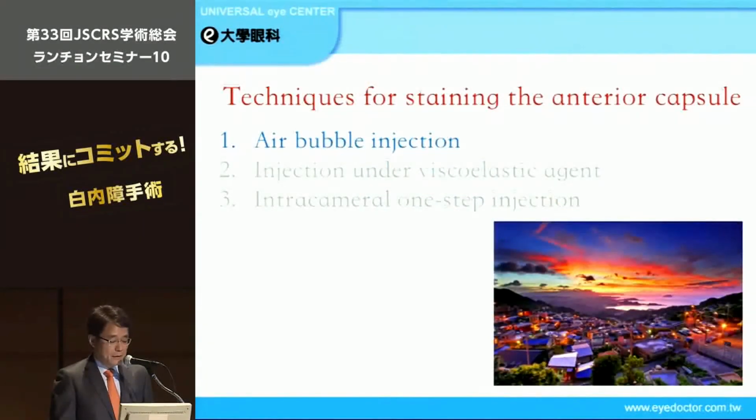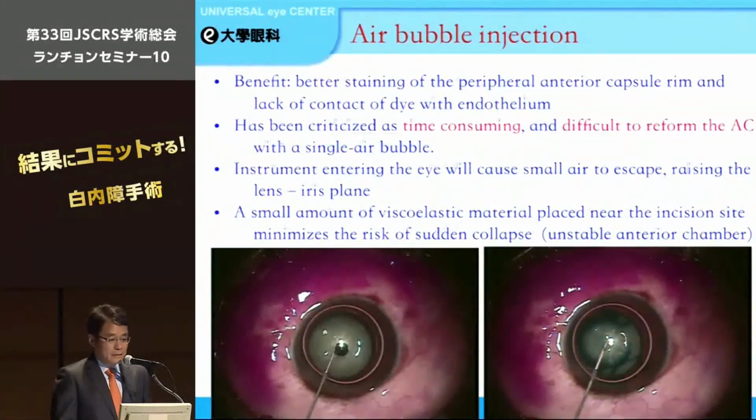The first technique is air bubble injection. This technique is very easy. However, it is criticized as time-consuming and difficult to reform the anterior chamber.